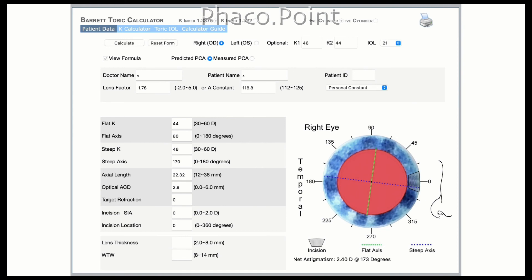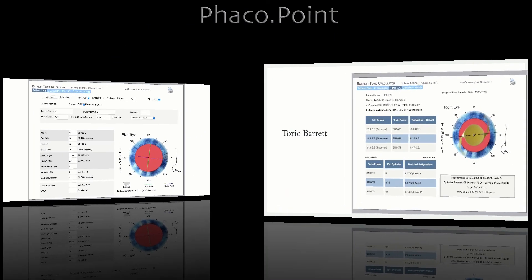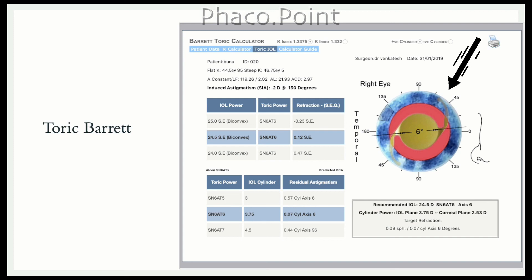The entered values will be visible on the eye diagram in the lower right-hand corner of the printout. Please look at the eye diagram carefully and verify that all details entered are accurately represented. After confirming accuracy, click the Toric IOL button, which will suggest the IOL model, design, and axis of placement. This final calculation sheet can be printed or saved as an image for reference during surgery, and it will also show the expected residual refraction.